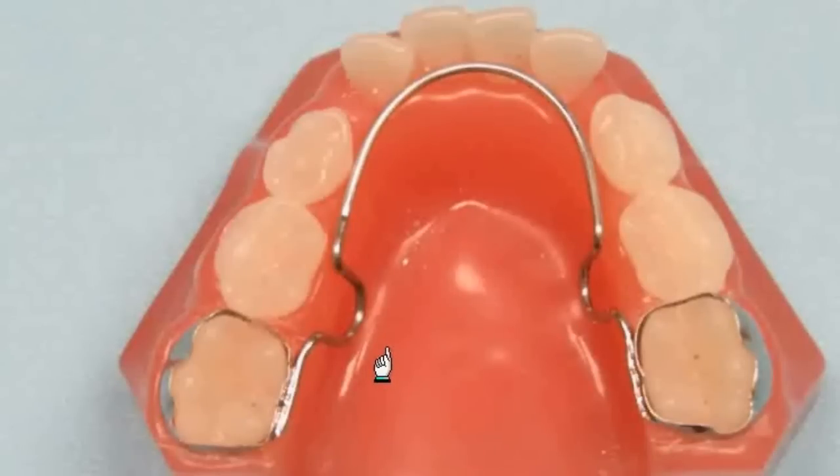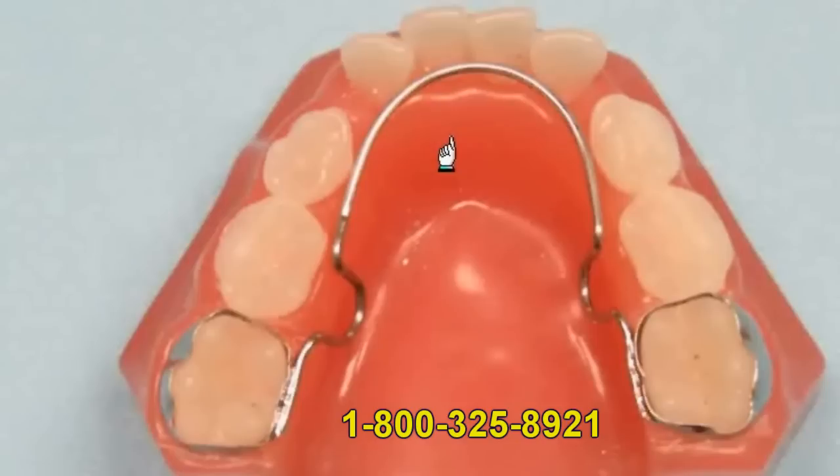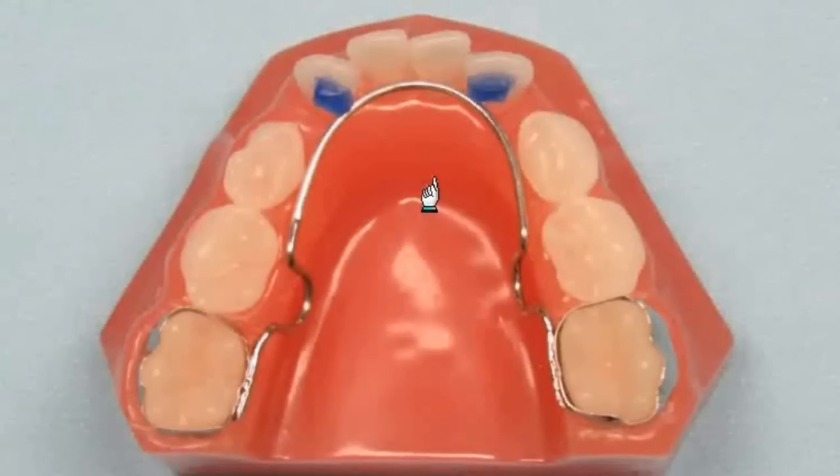Another addition to the lingual arch are loops. Some doctors like to add loops mesial to the first molars to allow for some adjustments. In some cases, you may want to flare the anteriors forward to recapture arch length that may have already been lost. This occurs most often when the cuspids are lost early. The anteriors may move lingual and the space for the permanent cuspids can be lost. The lingual arch will prevent any additional space loss and the loops can be activated to move the anteriors back to their correct position so there's room for the cuspids to erupt properly. You may want to add a small amount of composite to the lingual of the anterior teeth to create a shelf or undercut to prevent the wire from riding up the lingual of the teeth. The composite will make sure the force is directed properly so you get the most efficient movement possible.